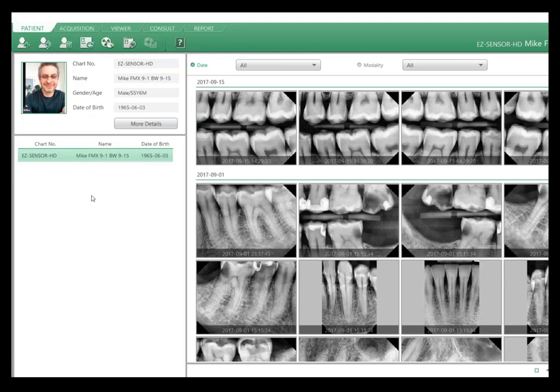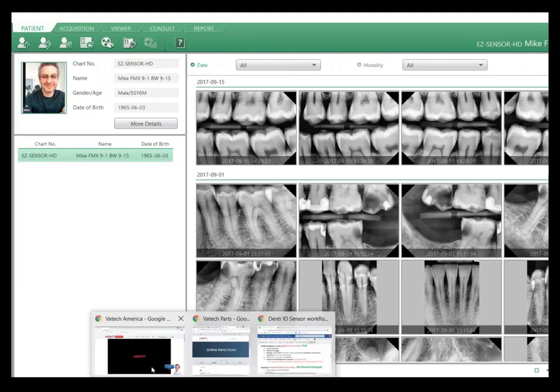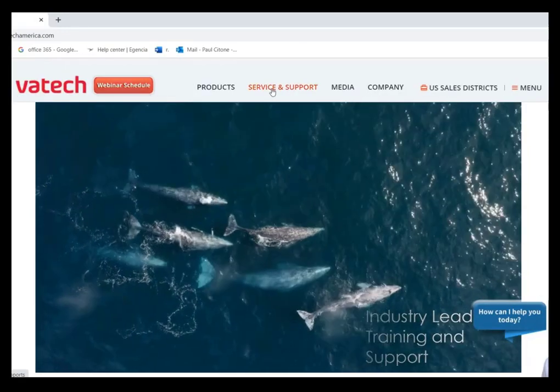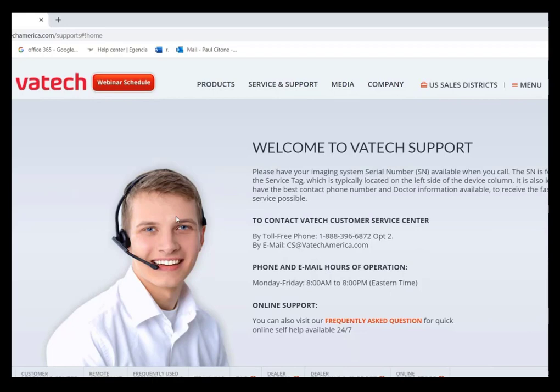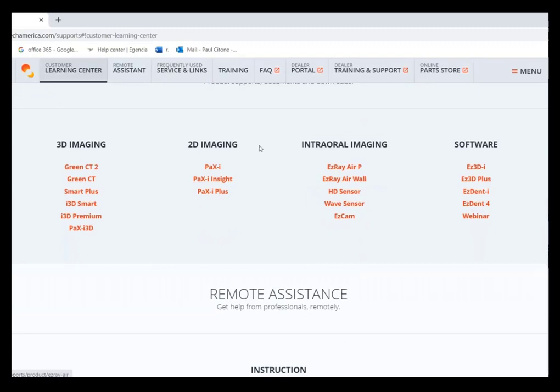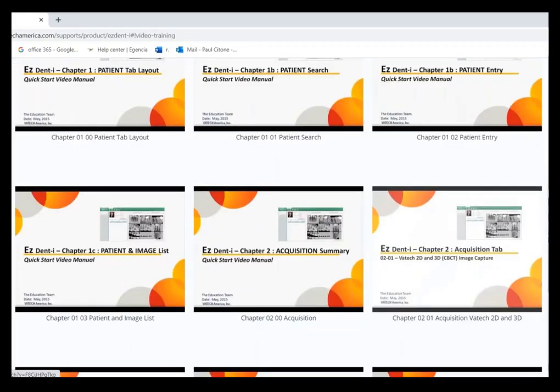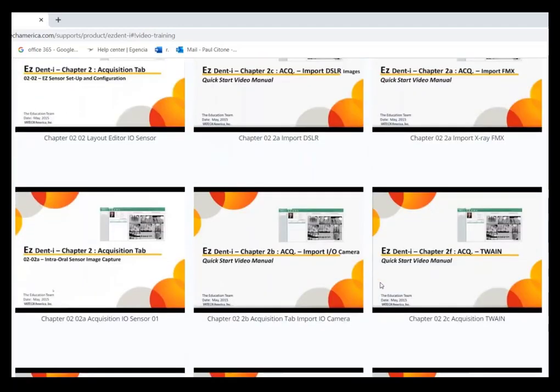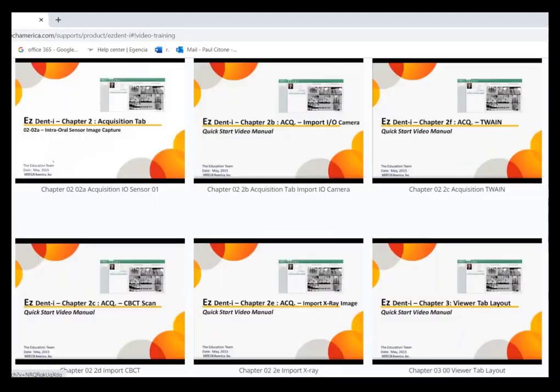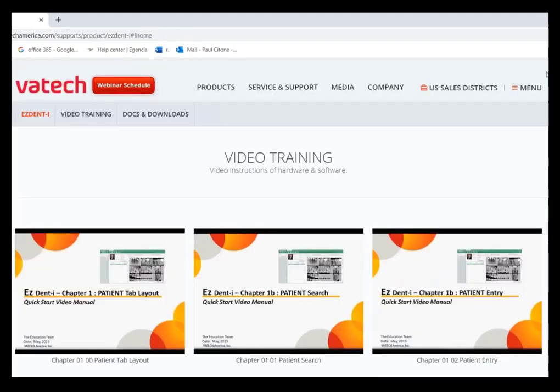Also, there's a lot of videos on our website in the Customer Learning Center about this too. I'm gonna pop that up in a second here on our website, vatechamerica.com, service and support here, and scrolling down past our friend here down at the Customer Learning Center. So there's videos here under intraoral imaging for the sensor itself, and then under the software column, EzDent-i, there's tons of videos in here on all of these topics. So everything sensor related, acquiring, changing layouts, custom layouts are here if you need it, which is a great resource.